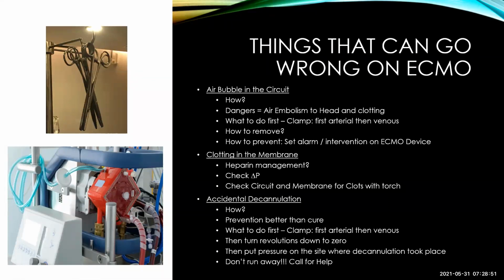So when we go on to ECMO initially, all kinds of things where air bubbles can come in, we will sort out. So for instance, your access site was too big and there's air sucking in there, or you've maybe nicked one of the plastic lines and there's a hole in there, so there can come air in there. That will be sorted out as soon as the patient is on ECMO in the cannulation situation. When your patient gets to the ICU, all of that will be sorted out already, after we've connected the circuit.